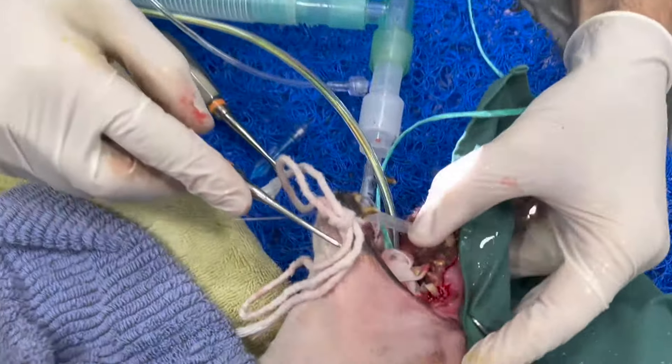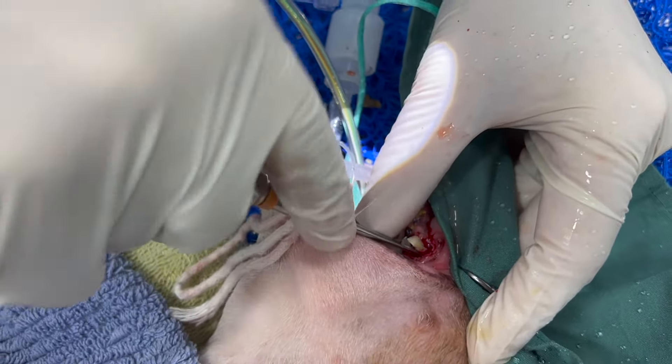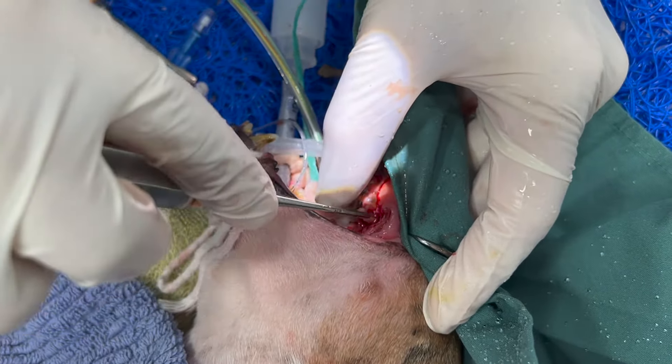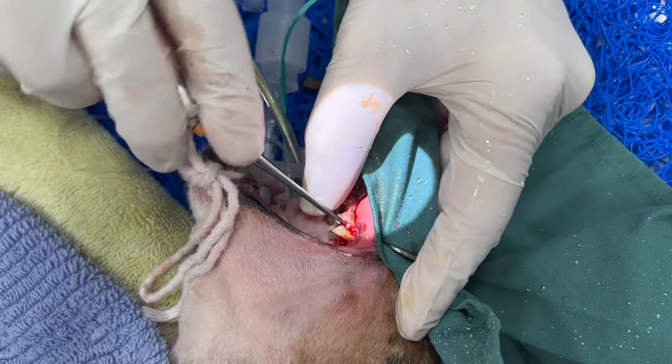We've split the roots again, and now I've got to gently start removing the second roots. Just very gently going around the tooth. It's not too exciting at this stage — I'll let you know when I've loosened it a little bit.